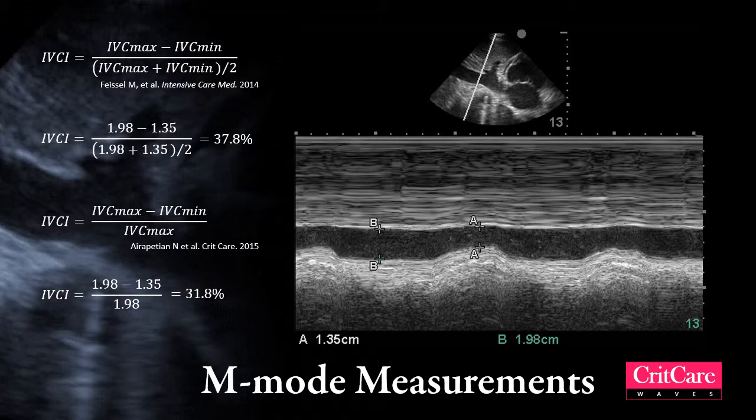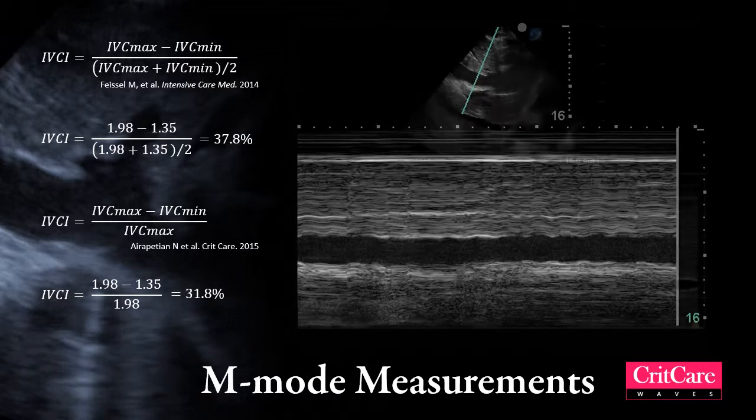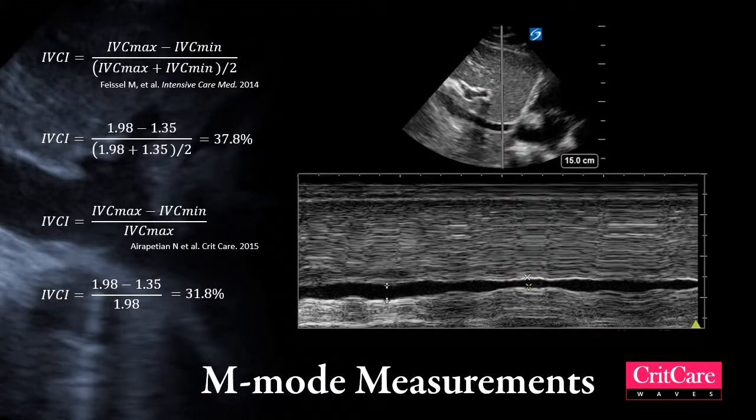This is an example of an IVC that's very distended and does not collapse with respirations, as opposed to this IVC that collapses a fair amount with respirations.